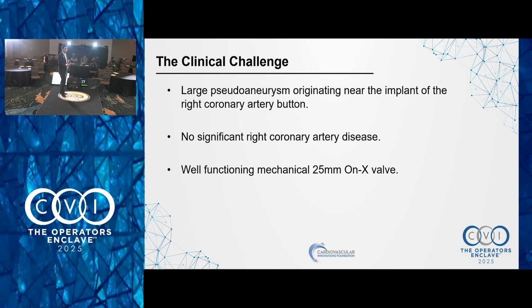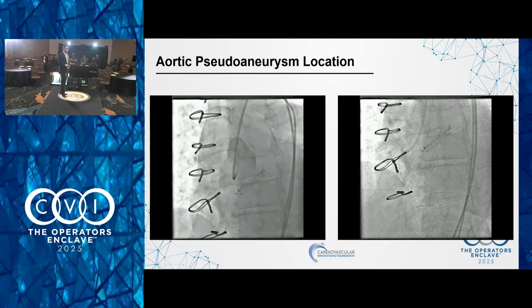Yeah, and with these pseudoaneurysms, sometimes you don't close them completely, and you see some contrast patency on follow-up CT, but it can be that way for years, and you just follow them. They can have this very slow permeation through whatever occluder, and the vascular surgeons usually say, as long as it's not getting bigger, we keep an eye on it. So even if you don't get an absolutely perfect result, it may be fine for the patient. Well, that's how we thought. So we should definitely go.